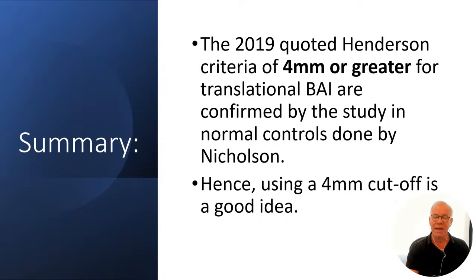So again, this is just another deep dive into a measurement that's used to diagnose CCI. And very important that we do this periodically to make sure the numbers we're using to diagnose CCI are accurate.